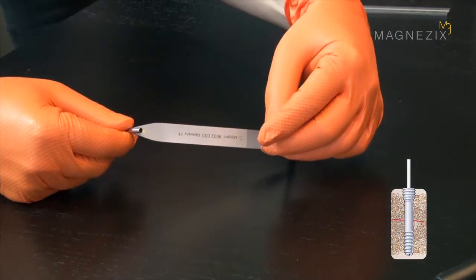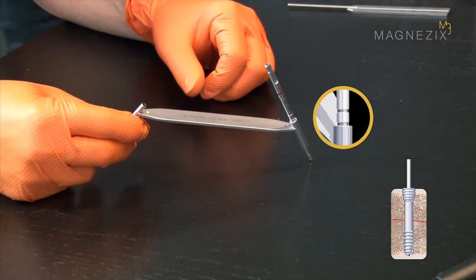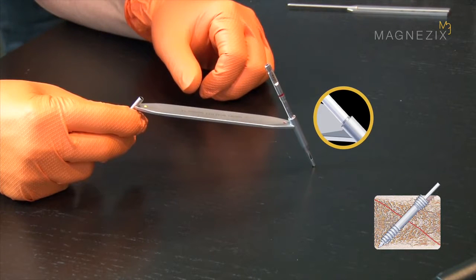If the screw is being positioned perpendicularly to the bone surface, you only need to countersink to the first ring marking. If the screw is positioned obliquely to the bone surface, countersink to the second ring marking to ensure the screw head lies flush with the bone.